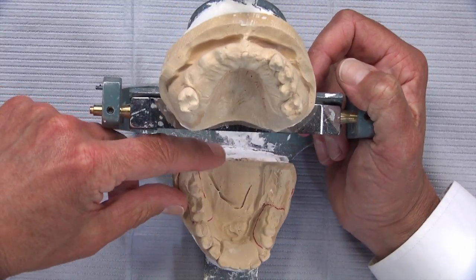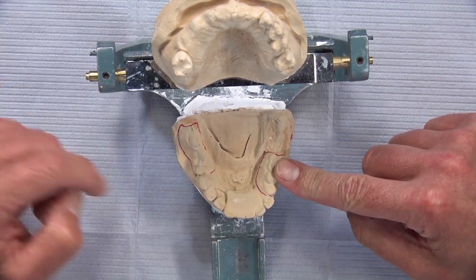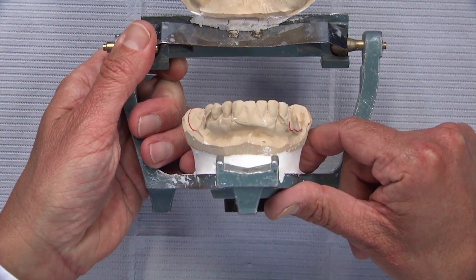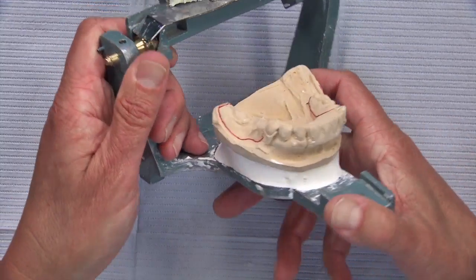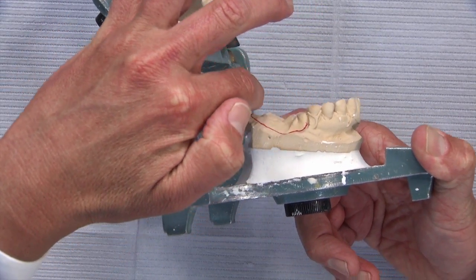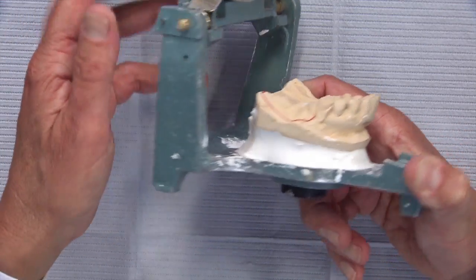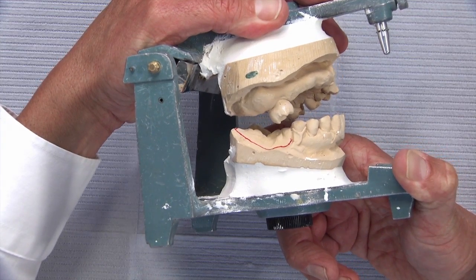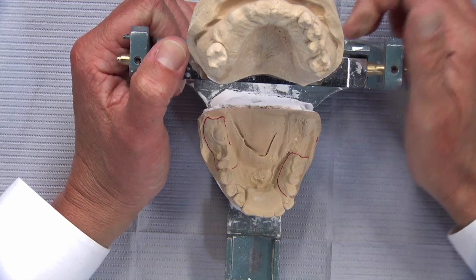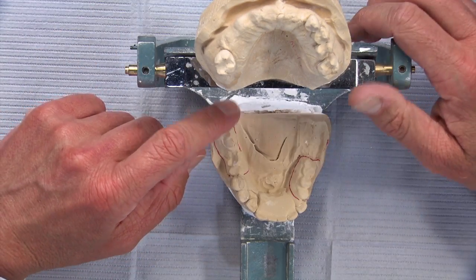The first one was remake the patient's lower denture as well. There's been a lot of wear on the other side, not as much as over here, and there's an anterior segment to it as well. But if the lower denture gets remade, all of a sudden the teeth can continue along the occlusal plane here, along kind of a modified curve of Spee, and at least we'll have enough room then when the patient bites together and stops here for the rest of those teeth that are on there. And the doctor called back and said the patient can't afford this option.